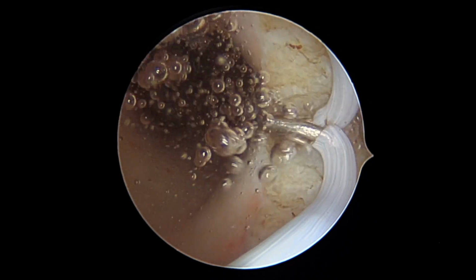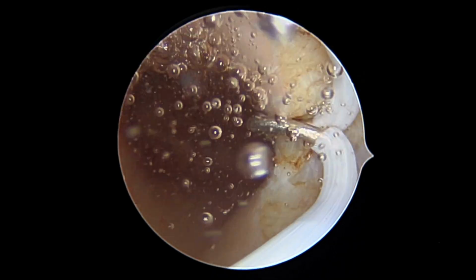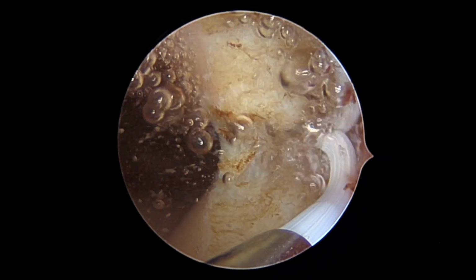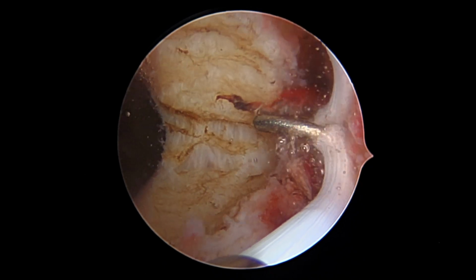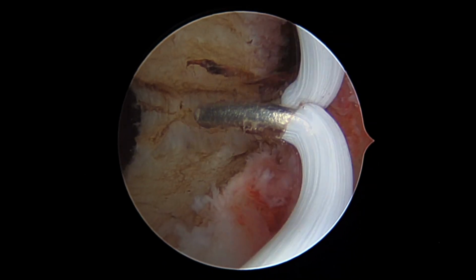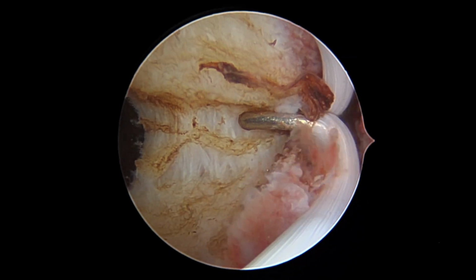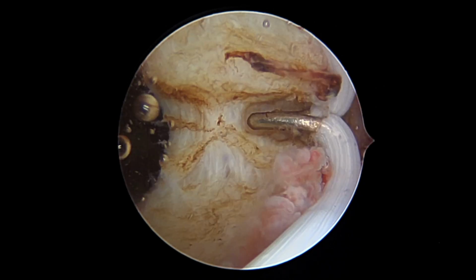The procedure is carried out under general anesthesia with the patient in a lithotomy position. An initial diagnostic saline hysteroscopy in this case was performed prior to confirm the suspected diagnosis. The technique in this video utilizes a monopolar resectoscope, hence glycine is used as the distension medium.